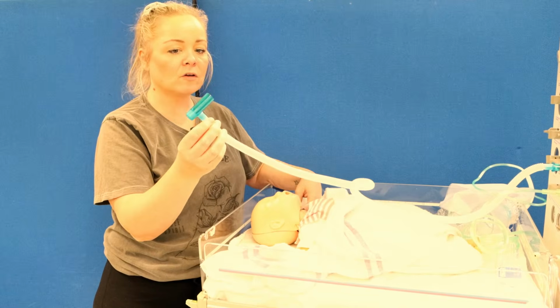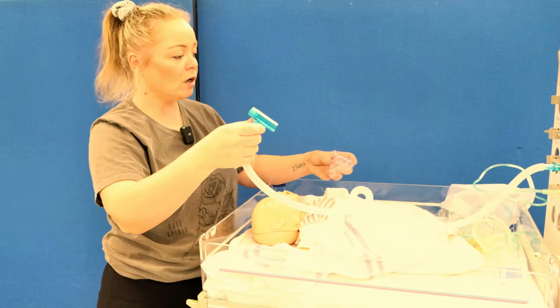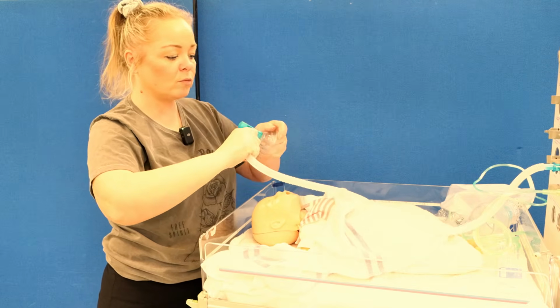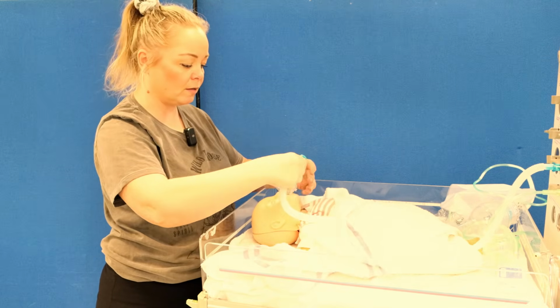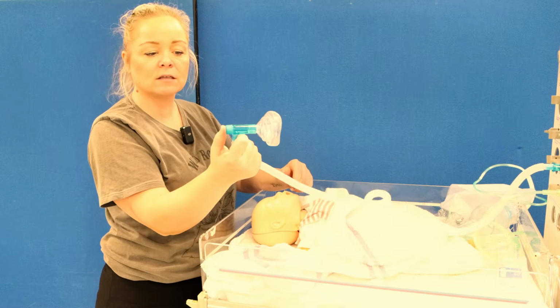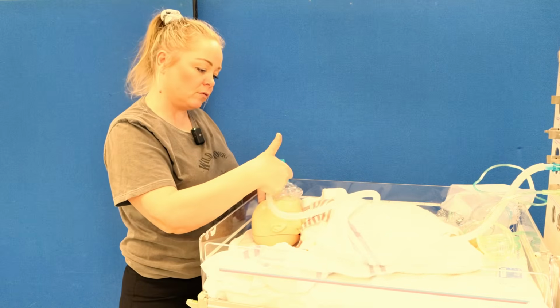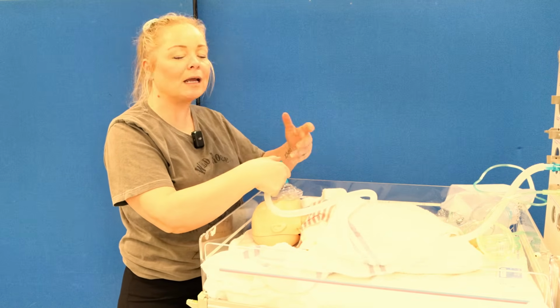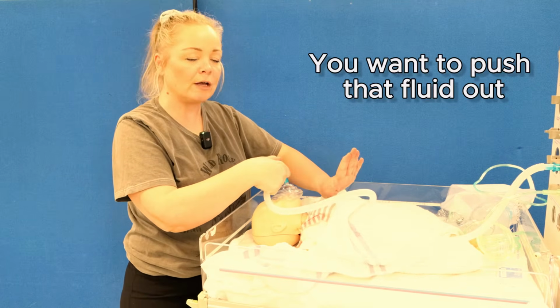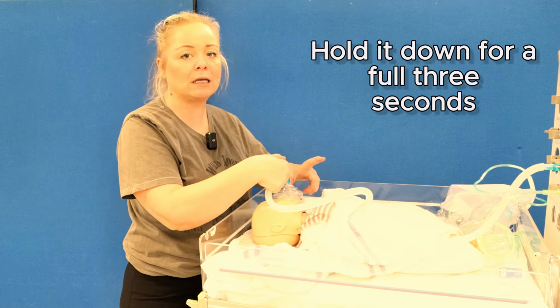The other piece of kit you've got is the TP, so it will be attached to your resuscitator, and it works similar to the bag valve mask, but with this one you attach the mask to the TP, put it on the baby's face, and then to occlude the hole, that is your breath. So we're not going to go 1, 2, 3, 1, 2, 3, 1, 2, 3. Again, like I've just mentioned, you want to push that fluid out. So you're going to hold it down for a full 3 seconds.